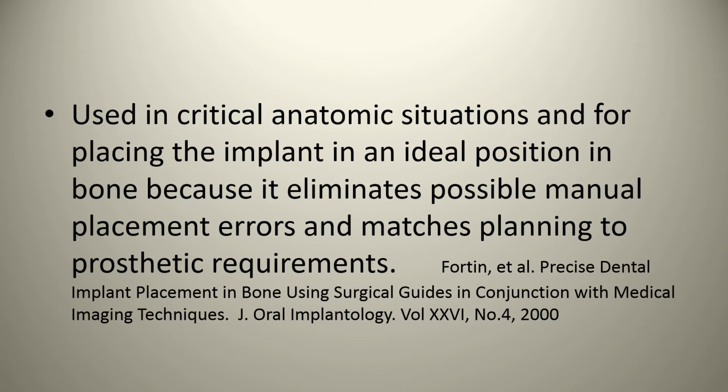So cone beam CT scanners or stents can be used in critical anatomical situations and for placing the implant in an ideal position in bone because it eliminates possible, and the key word here is possible, manual placement errors and matches planning to prosthetic requirements. And this was a study which was proposed back in 2000.